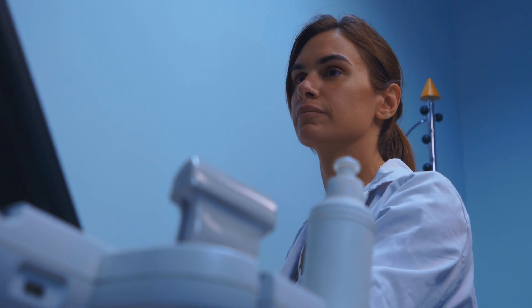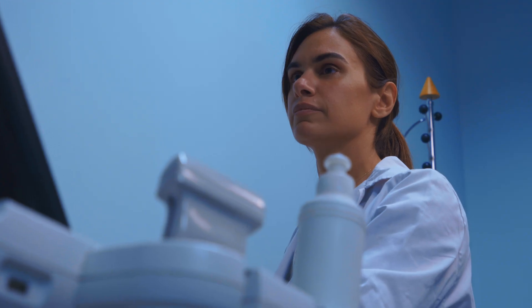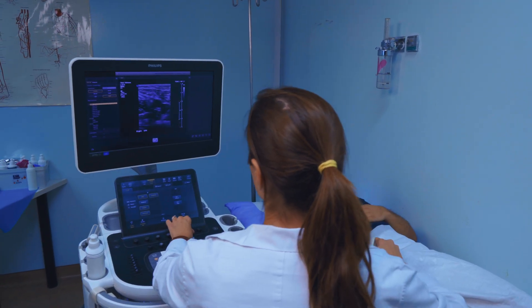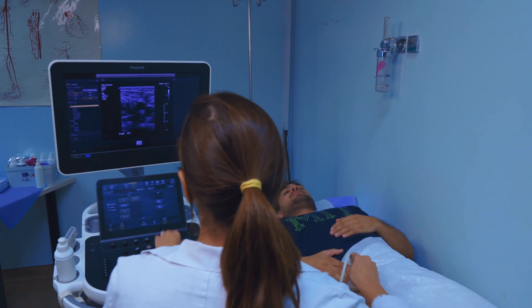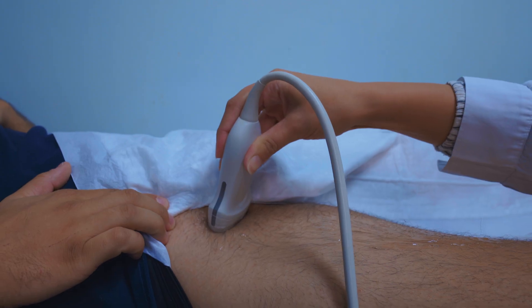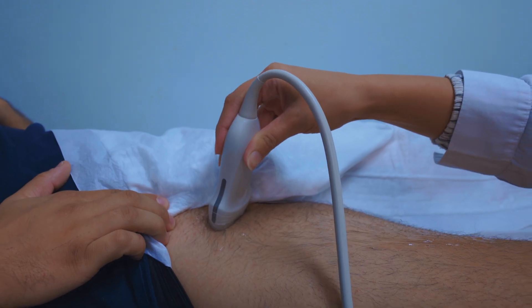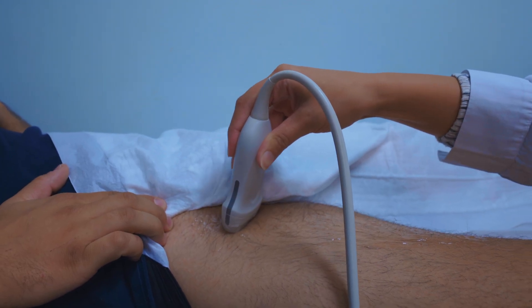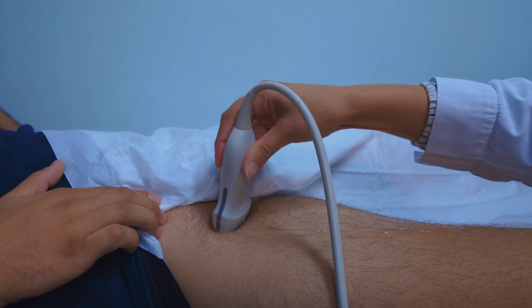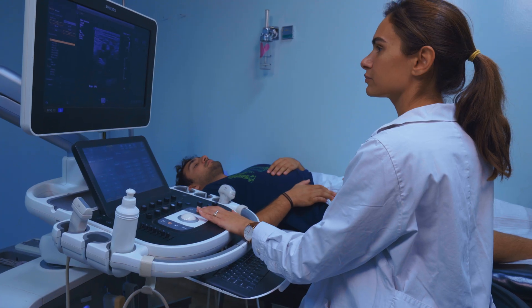Our standardized protocol guides physicians through a comprehensive examination. The scanning process focuses on four specific anatomical locations along the leg. We begin high on the thigh in the subinguinal area, capturing transverse views of the major vessels.